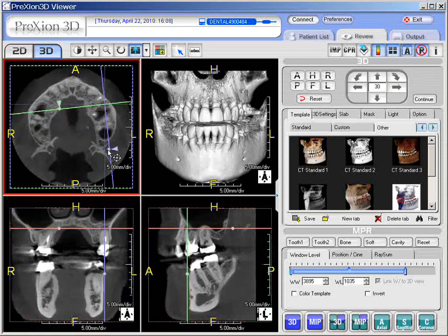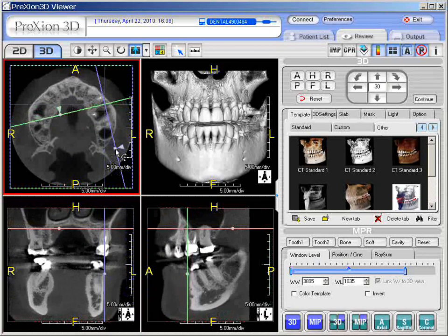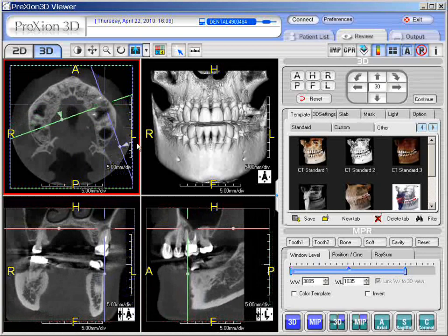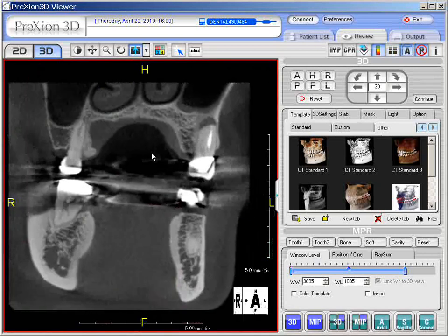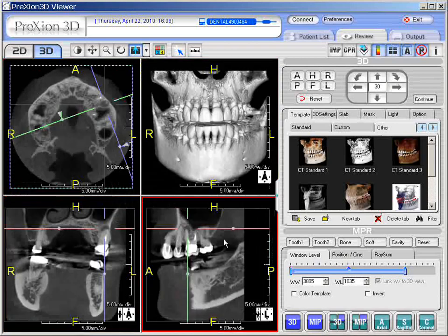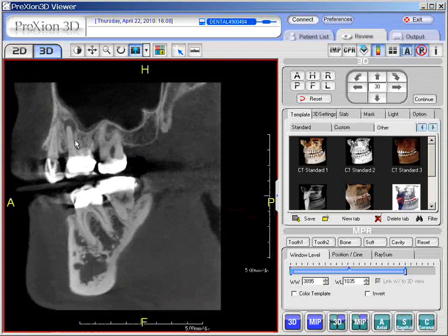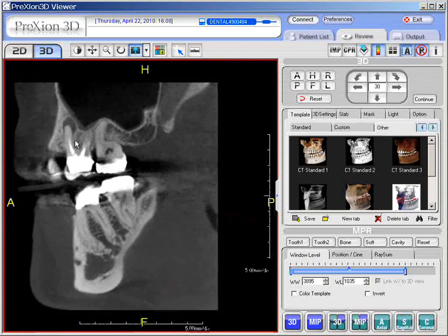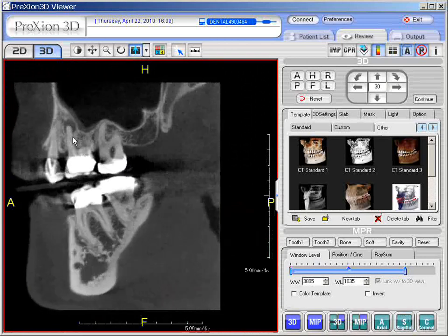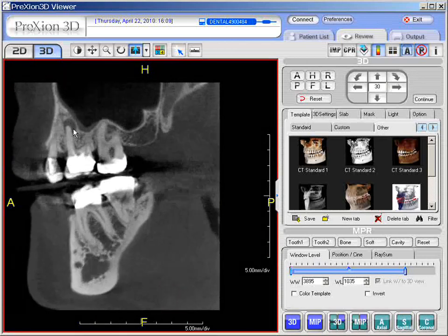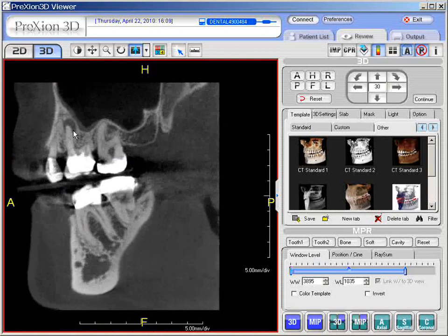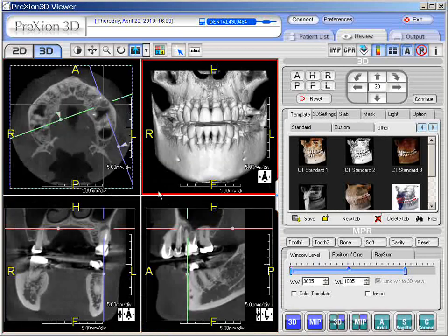We're going to take the anchor point on the blue line and rotate it very slightly so it's aligned to the left side. Here we have the view in the coronal. I can double click and slice through, or go to the sagittal projection — loading up sagittal — and slice with the middle wheel of the trackball back and forth. One could get a nice projection as we're multi-slicing through in sagittal. By doing the Alt key, we have it in all three views — that's the beautiful thing about using the Alt key and selecting it in all three views.